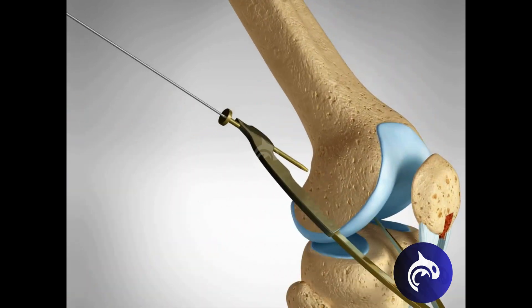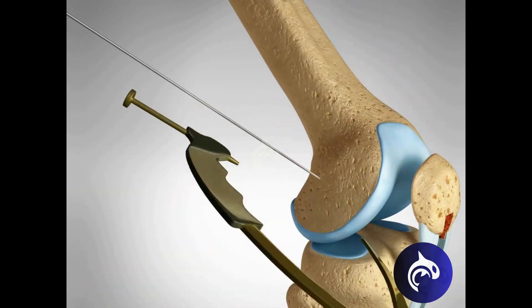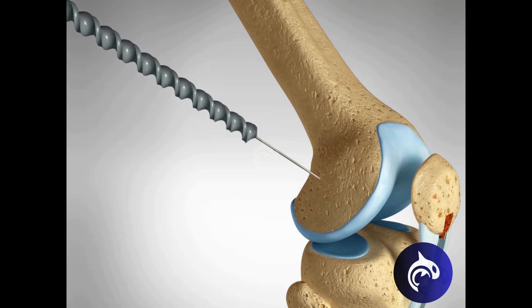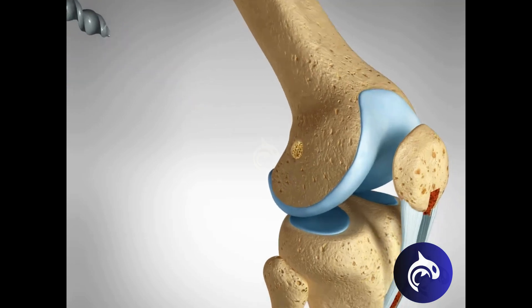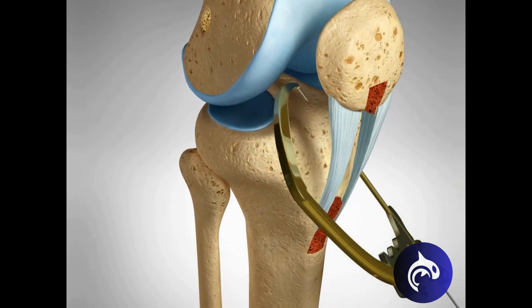Next, precise bone tunnels are drilled into the tibia and femur at specific angles that replicate the original ACL's natural path. This step is critical for proper knee function and long-term graft stability.